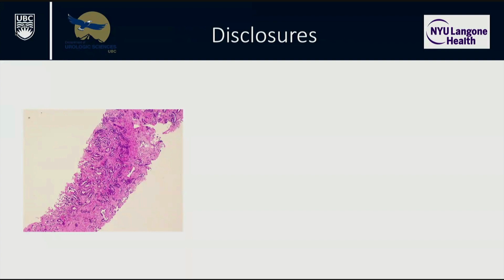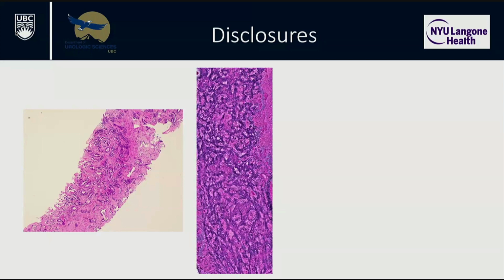Okay, great. So this is a prostate biopsy. This is on H&E. It can take, on average, a week, 2 weeks to get results back, and sometimes longer. There's a shortage of pathologists, and there's a shortage of pathology techs, and it puts strain on the system. This is something called stimulated Raman histology, which we'll talk about. This is developed in minutes without requiring any pathologic processing or techs.